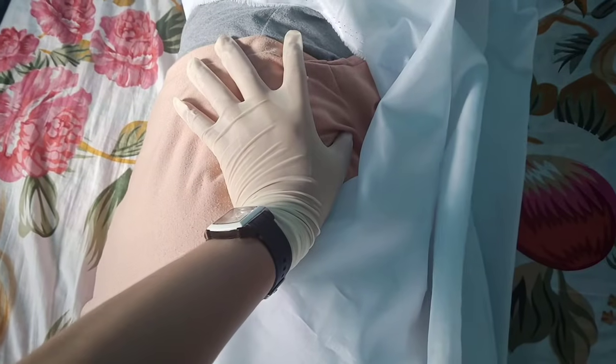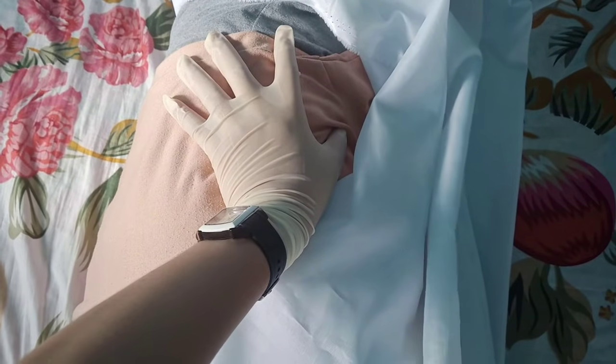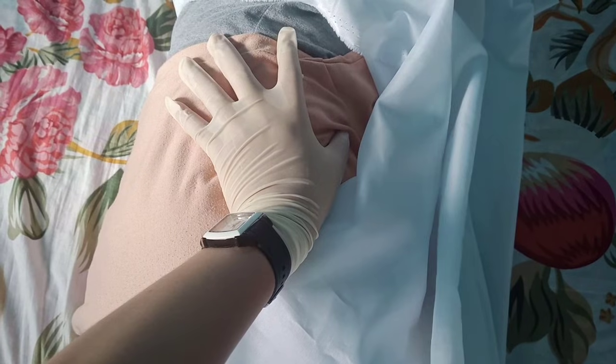Now help the patient find the comfortable position that will accommodate the injection site you've chosen and expose only the portion of the body. So my patient is in a side-lying position. Now apply gloves and use anatomic landmarks to find the site again. For ventrogluteal injection, place the heel of the hand over the greater trochanter of the patient's hip with the wrist almost perpendicular to the femur.